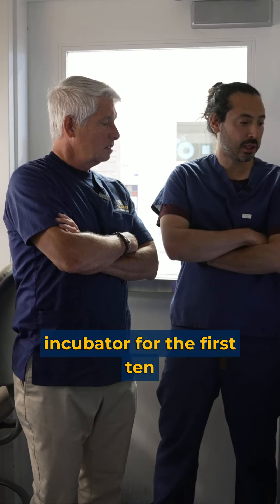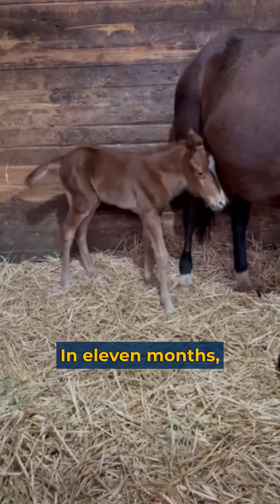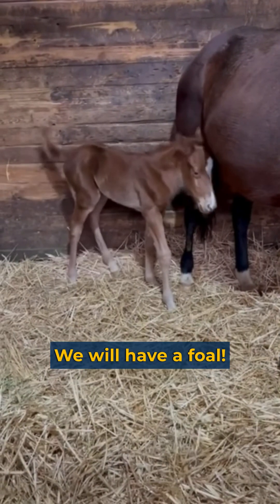They're living here in this incubator for the first 10 days of their life, and then they're put inside a mare. In 11 months we will have a pregnancy — they will have a foal.